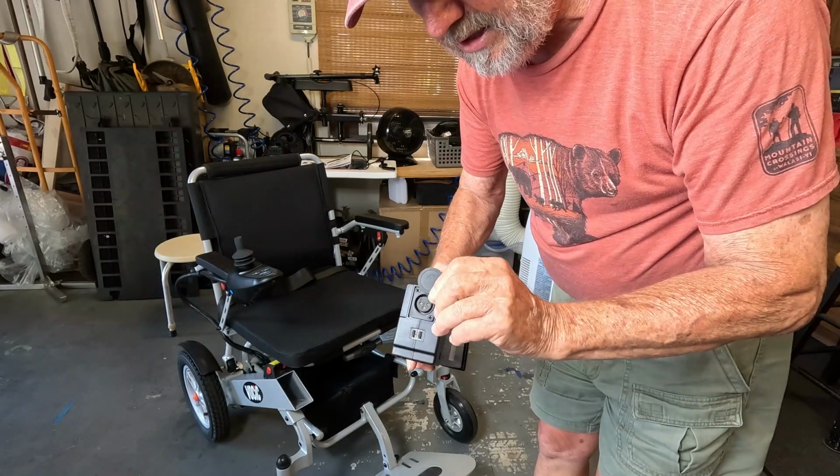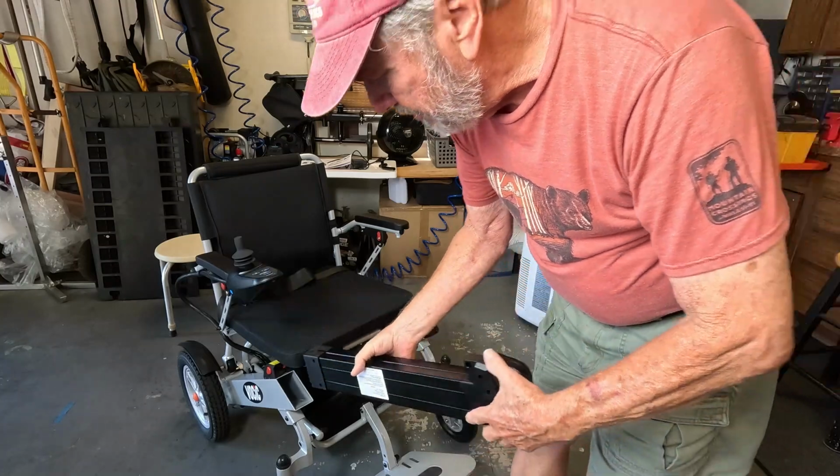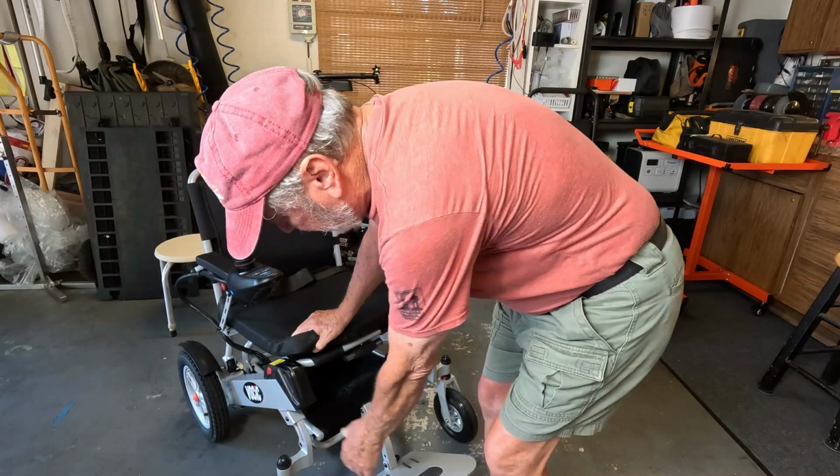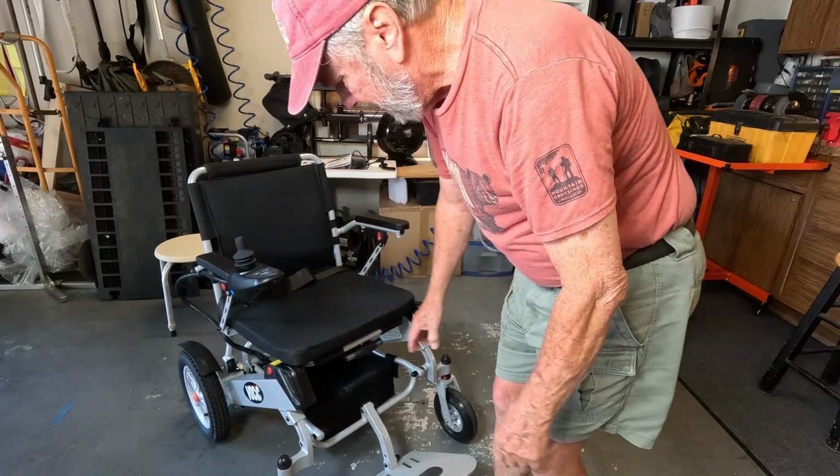And then you slide this back, then you put this back in, and then this will just snap right in there, and it's seated.